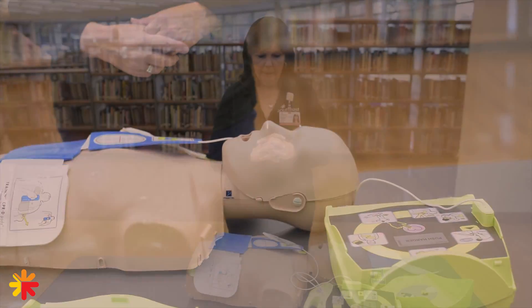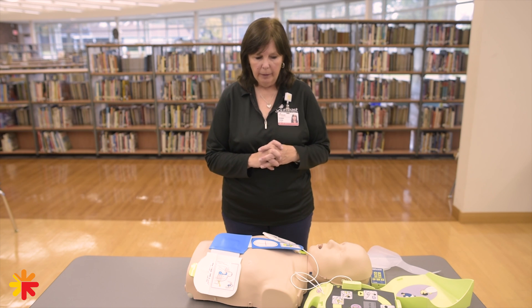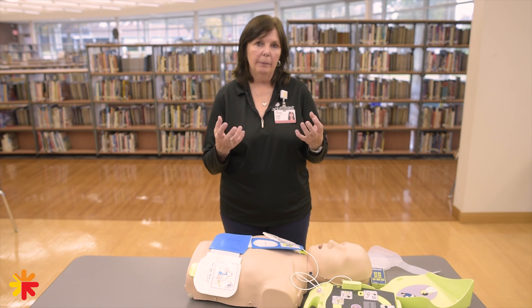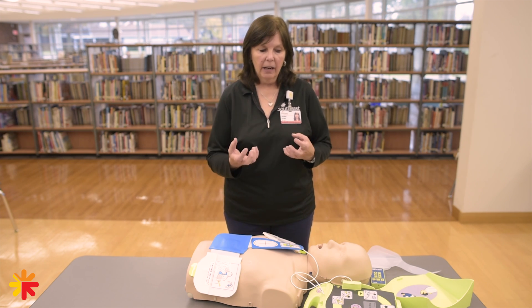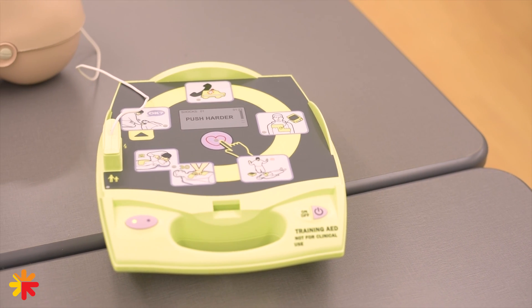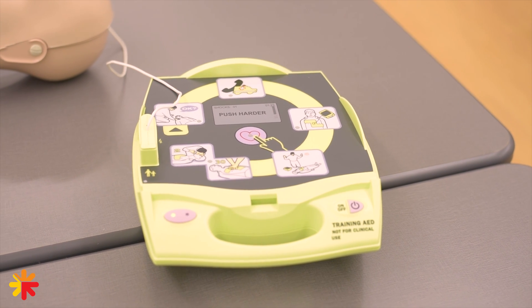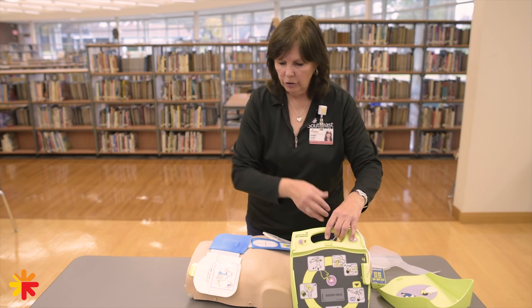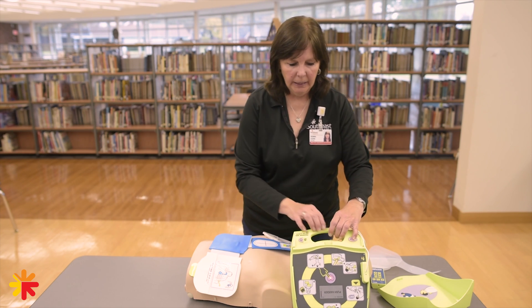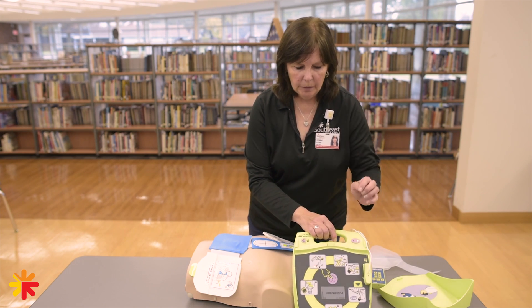We will not touch the patient while the AED is analyzing the heart rhythm. The AED only works if the bottom of the heart is in a quiver mode called fibrillation — if it has a heartbeat, it will not shock. There's a shock button in the middle, and you have to make sure nobody is touching the patient or anything around them before you push the button.